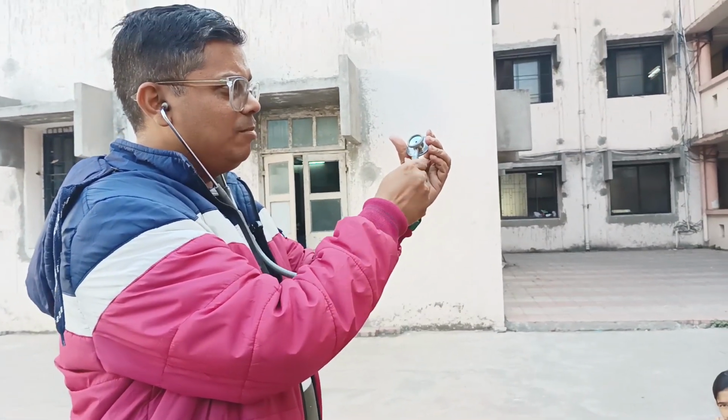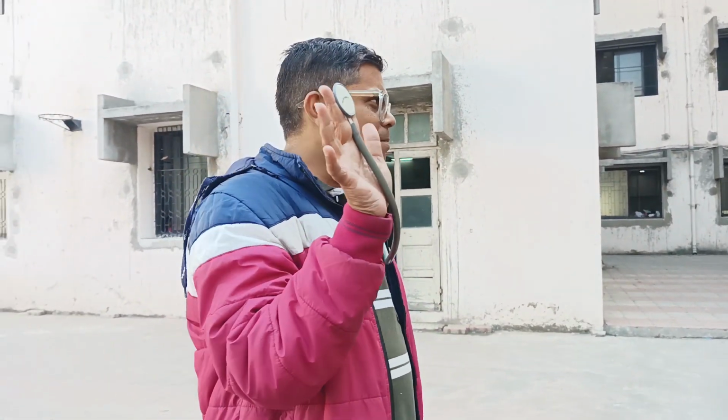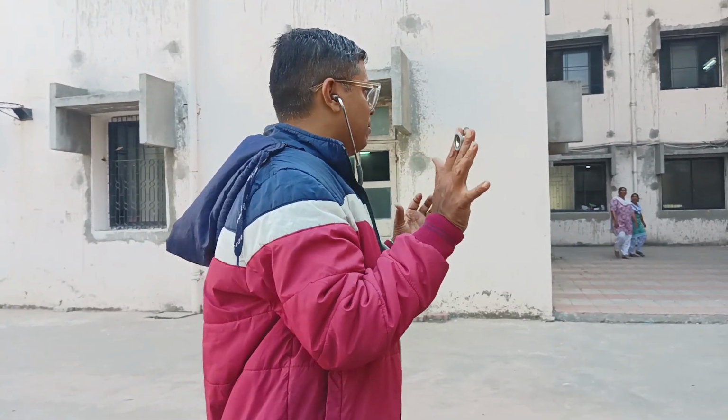Okay, if sound comes, then here you have to turn it on, and every part of the body has vibration. A good doctor can understand that vibration. Okay, so in different parts of the body, different vibrations are there. You have to try to understand. Correct, here I will hold like that. Just put it here.